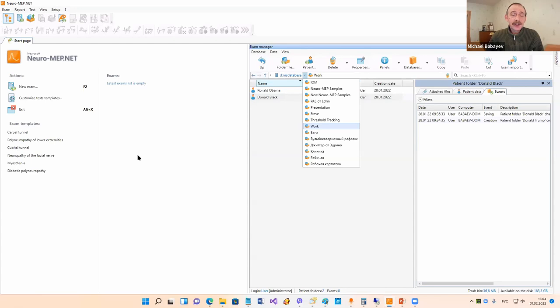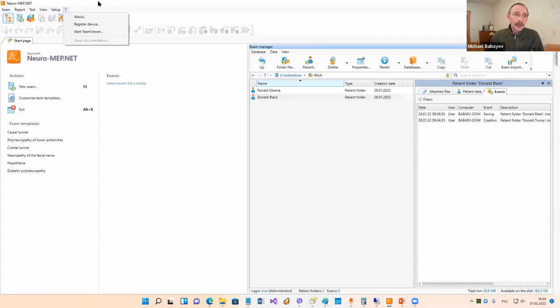Our program is a standard Windows program. You can use the main menu and work with it via the menu. We also have some toolbar buttons that duplicate some menu commands. On the start page we have some big buttons, a list of exam templates, and an exam manager. In the exam manager you can see previously done examinations. To create a new examination when you see a new patient, you can use this button - New Exam.